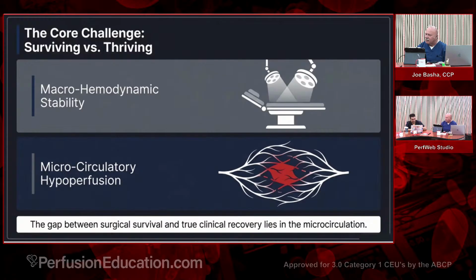But here's the difference. The systolic blood pressure on the radial was 75. It was 127 on the femoral. That's a big difference. So we're perfusing the entirety of that case at a macro hemodynamic condition, or using that as our metric. What did we do throughout? This patient did great, surprisingly enough. No issues. Great. But what did we do at the microcirculatory level?